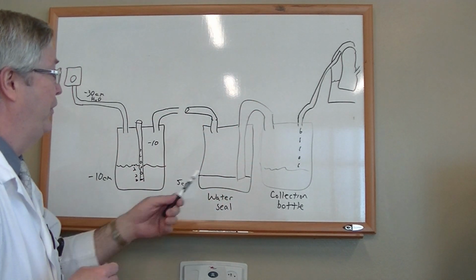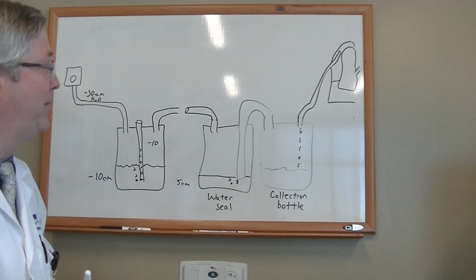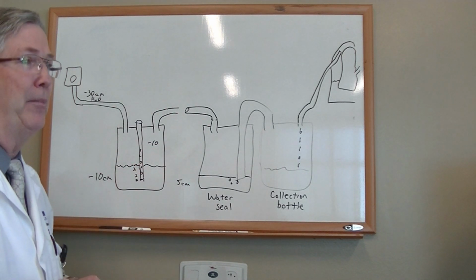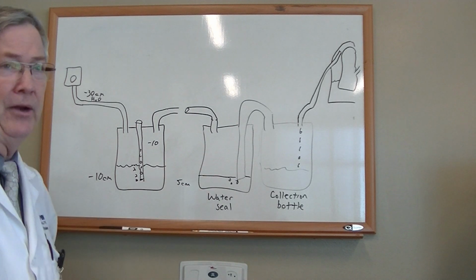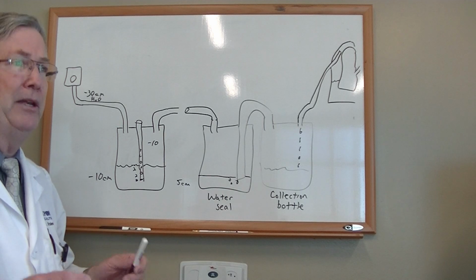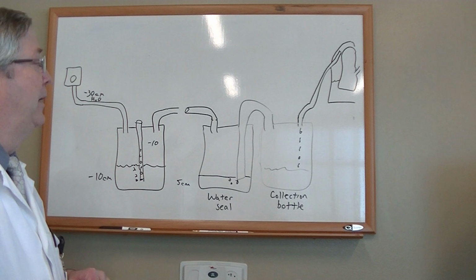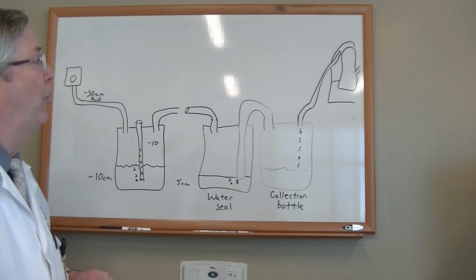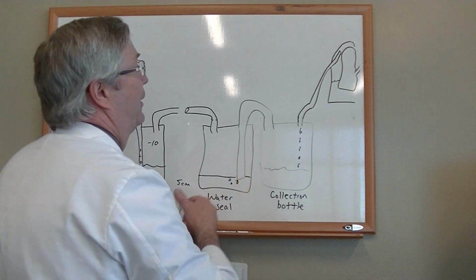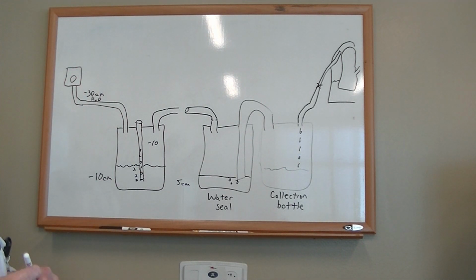When we're on a water seal, if we see bubbles coming out, that means there's still a pneumothorax. And almost no point in checking an x-ray at that point. We already know that. But let's suppose we don't have any air bubbles coming out at that point. Then we can check an x-ray, and it should show that the lung is up and has maintained itself in the open position. If that's the case, then the next order might be to clamp the chest tube. And we're going to clamp it between the patient and the chest bottle.